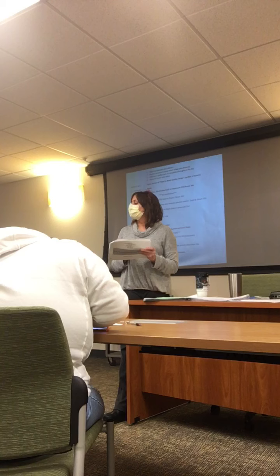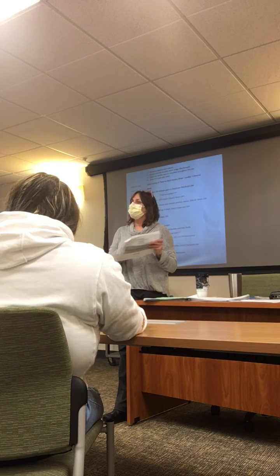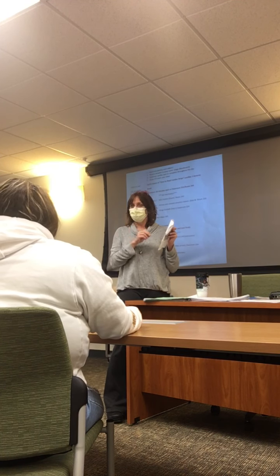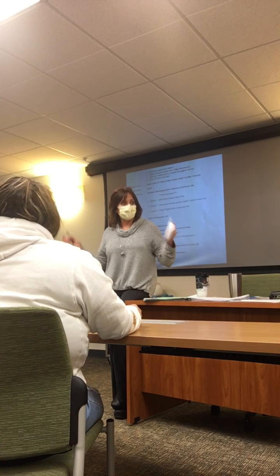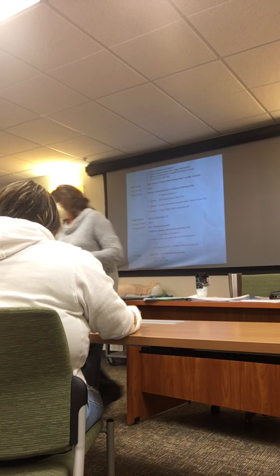What is a normal QRS complex? Less than what? 0.12. Is this more than 3? So it's telling me it's coming from the ventricles because it's wider. There's some kind of delay or defect in the ventricle. Yeah. It would be from here to here.